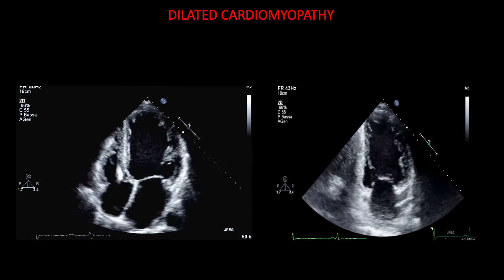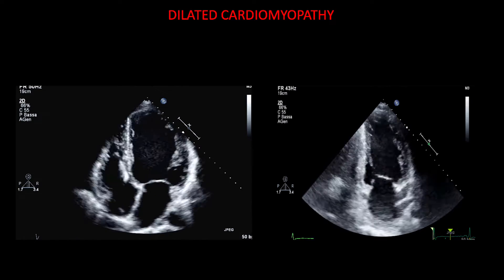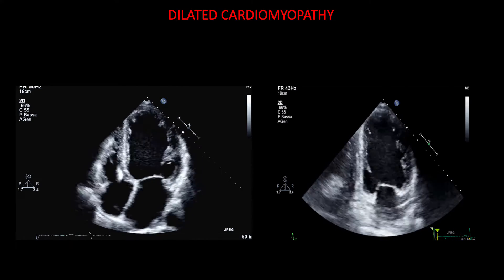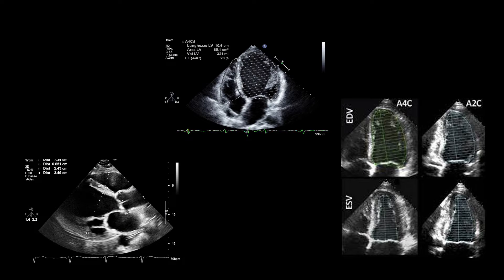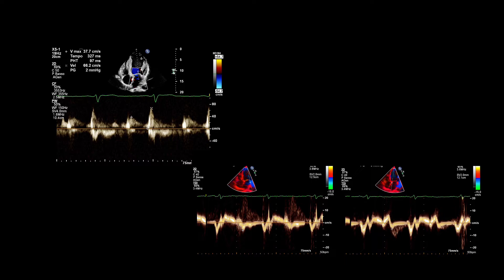Echocardiography has crucial importance in the diagnosis of dilated cardiomyopathy. Features of dilated cardiomyopathy include left ventricle dilation and systolic dysfunction with impaired global contractility and normal left ventricle wall thickness, as well as left ventricle diastolic dysfunction with elevation of left ventricle filling pressure.